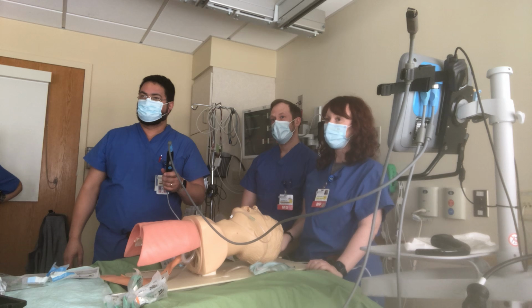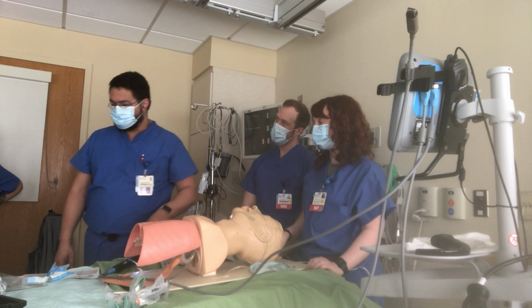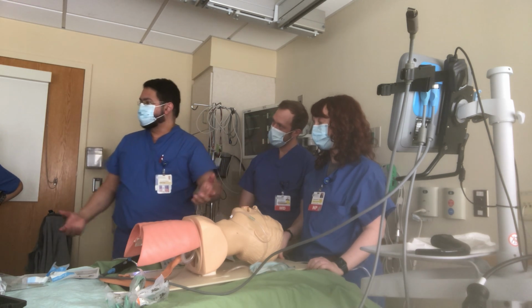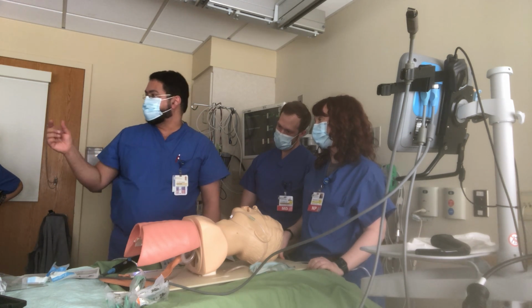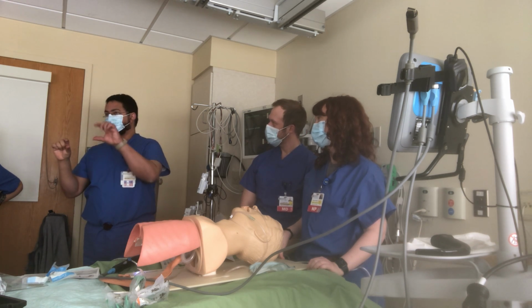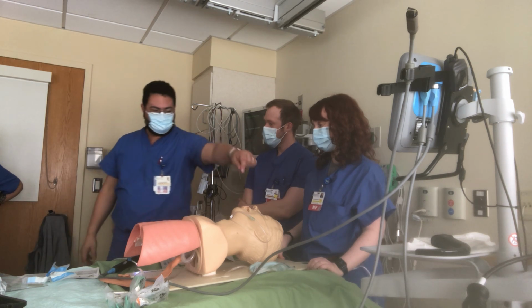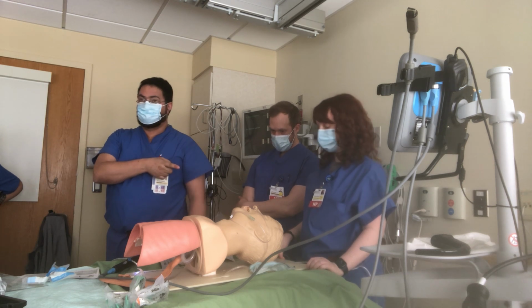You have Afrin nasal spray and Neo Lido soaked Q-tips. These are not really 100% necessary, but it's done in case we're going to do a nasal intubation. So this guy with a big tongue going out like this, we're going to do a nasal intubation. So what we do is we use a lot of Afrin, and then we make a solution. We get a small vial of Neo, which is 10 milligrams, and the rest is 9 cc's of 2% lidocaine. Put them both together, mix them, and then get Q-tips and start putting the Q-tips very, very slowly in the nose.